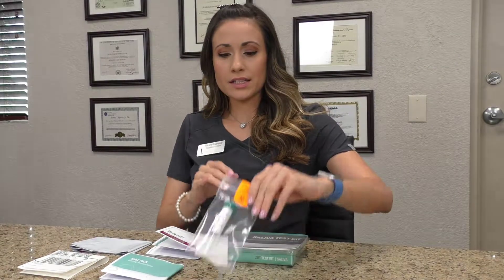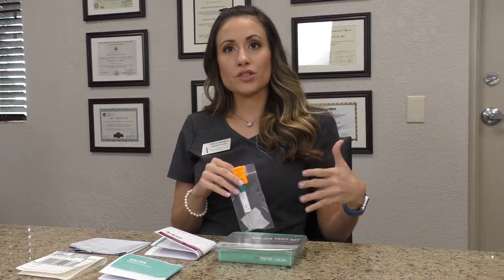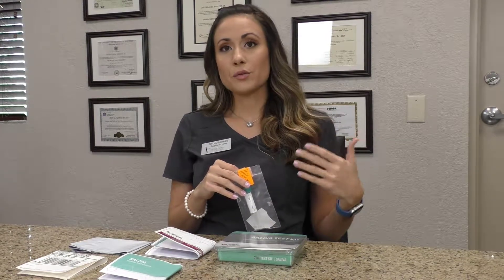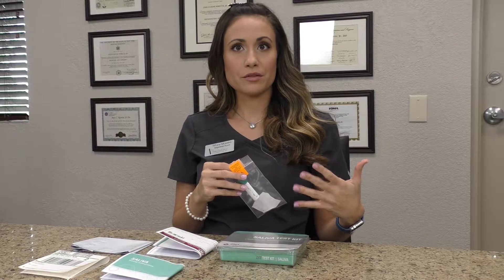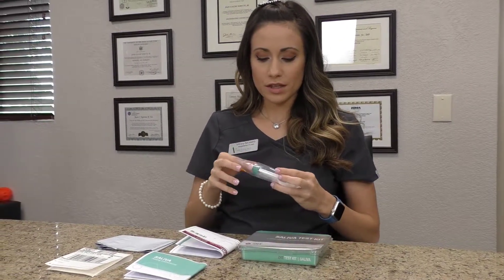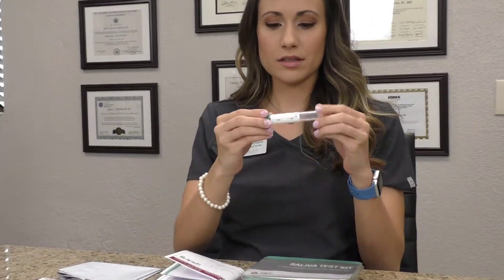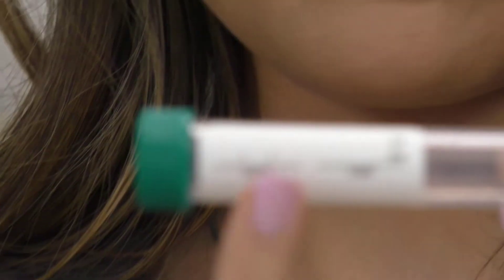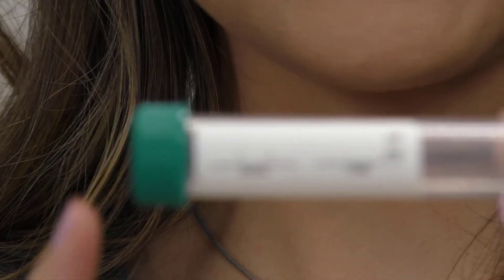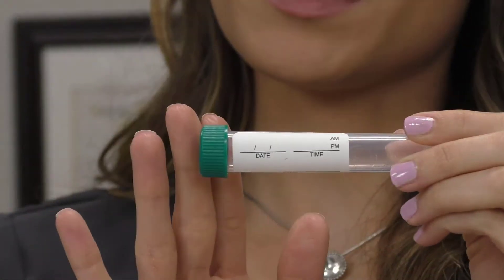Now I will tell you how to take the sample. The first thing you're going to do is make sure your mouth is clean. You can drink water and rinse your mouth with water, but don't have any food or any type of beverage other than that before taking your sample. Take the tube out of the bag — you can see on the tube you're going to put your name right here, and also the date and the time that you do your spit sample. Make sure the tube is labeled.